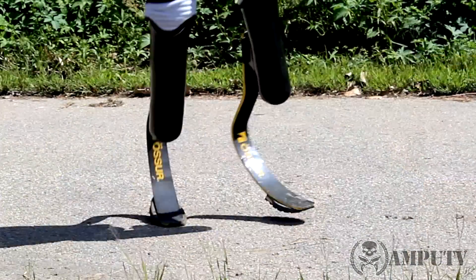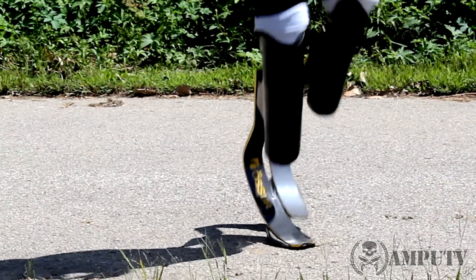The main point of running blades is to replace the ankle and the calf, because that's what amputees lack. They're all made out of carbon fiber. Why? Because carbon fiber is very light but also very strong, and not only that — carbon fiber literally compresses like a spring. That's why you have this shape, to optimize the springiness. Generally, the more carbon fiber you have on a blade, the more springiness you get.